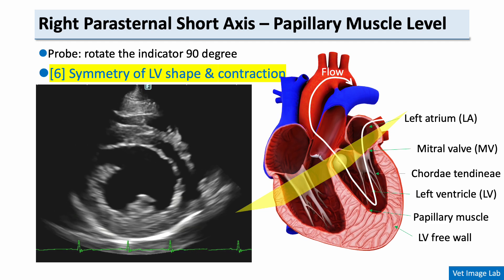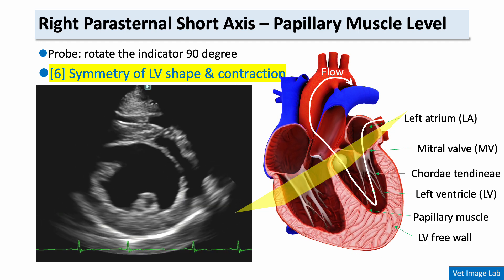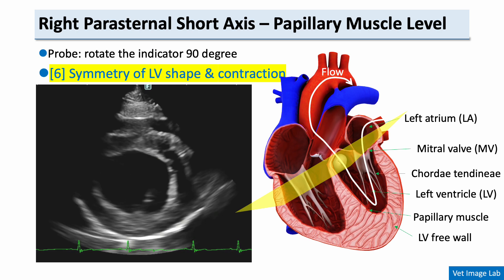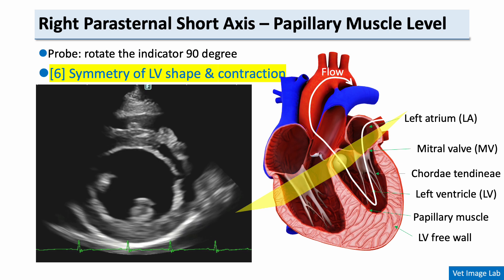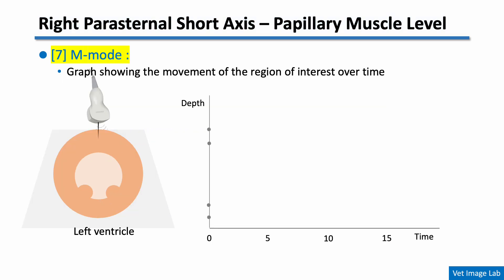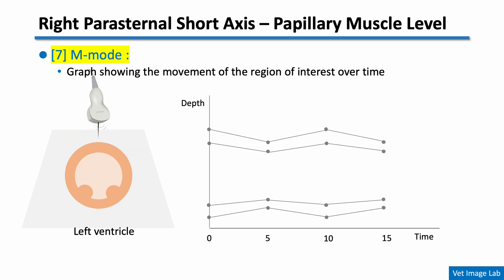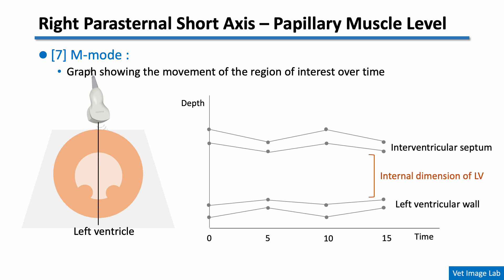Now let's rotate the probe 90 degrees from the long axis view. This gives us the right parasternal short axis view at the level of the papillary muscles. You can see the left ventricle in a circular cross section surrounded by the free wall and the interventricular septum. Here, we assess the symmetry of the left ventricle, both in shape and contraction — the left ventricular wall should contract evenly, maintaining a round shape throughout systole. In this view, performing M-mode is important. When you place an M-mode line across the left ventricle, the ultrasound captures the motion of that line over time and shows how the left ventricle moves throughout the cardiac cycle. The upper line represents the interventricular septum, the lower line corresponds to the left ventricular free wall, and the distance between them indicates the internal dimension of the LV.